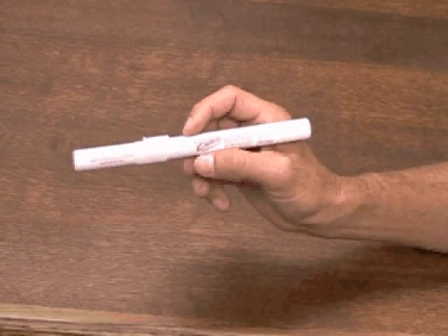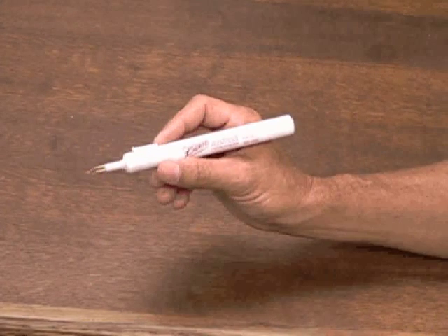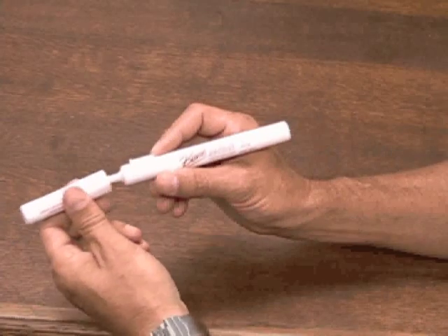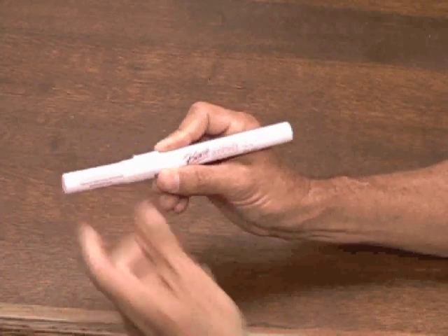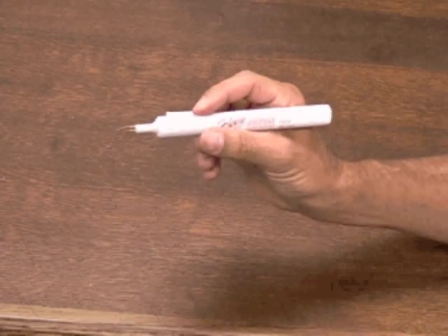It is important to retain the safety cap throughout the procedure. Replace the safety cap when cautery is not in use and for proper disposal. To activate cautery, simply press the button.